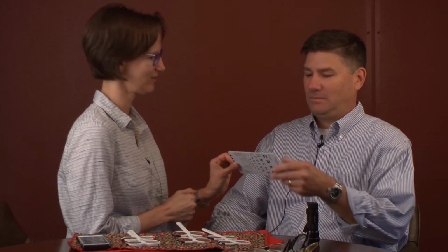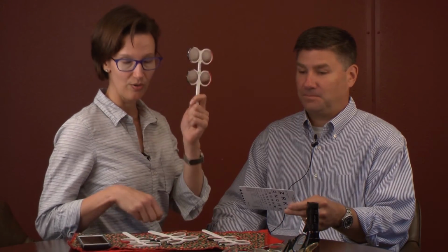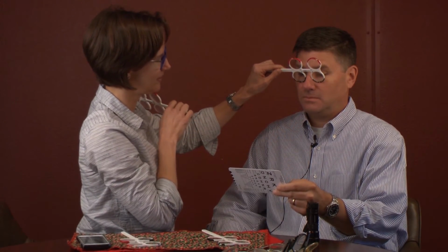So do you have trouble seeing things far away or up close? Up close. All right, so I'm going to hand you a reading card in Spanish. And I'm going to start with the +2, never negative, always positive. So we'll start with the +2. Are the words on the card better with those lenses? Better. So we'll go from the 2 to the 3 and compare those.